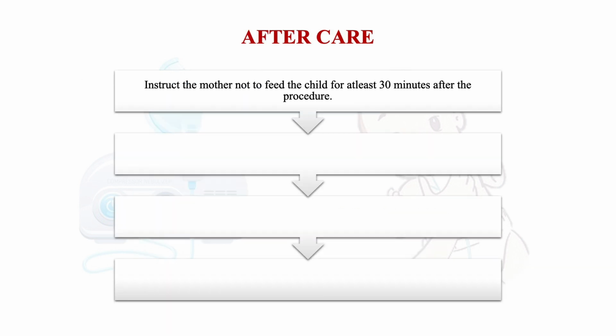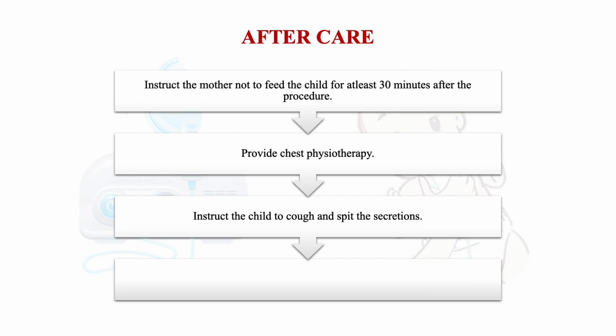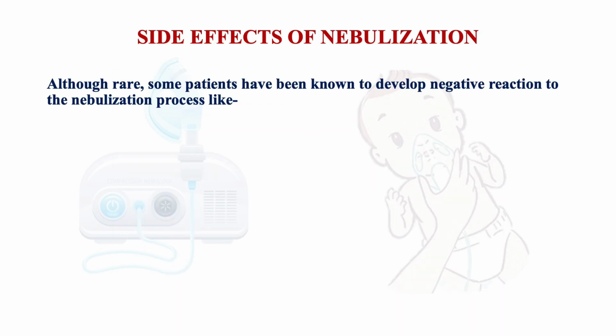The aftercare required. Instruct the mother not to feed the child for at least 30 minutes after the procedure. Provide chest physiotherapy. Instruct the child to cough and spit the secretions. Do recording and reporting.